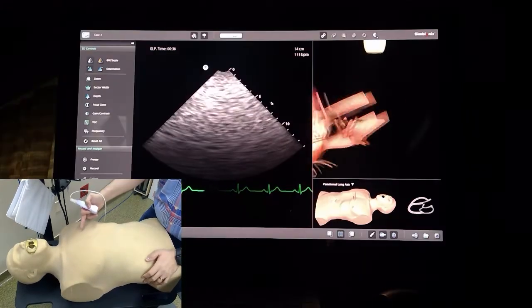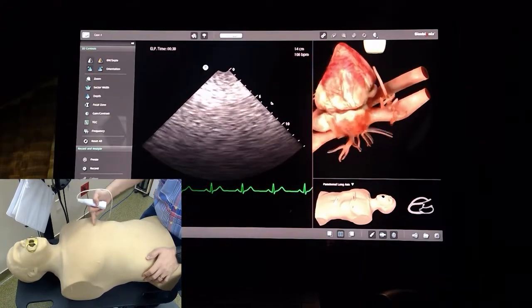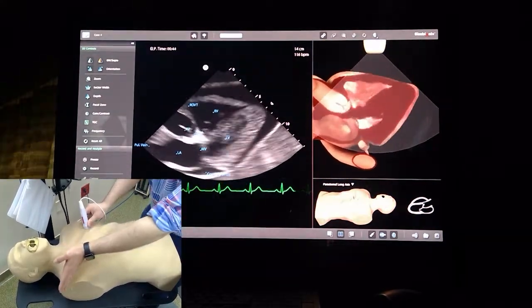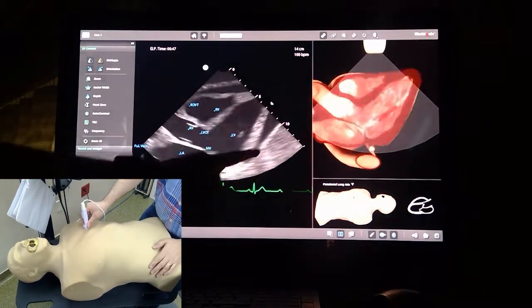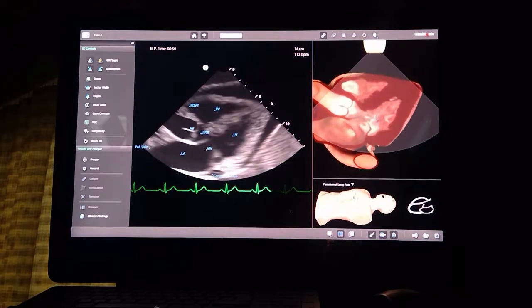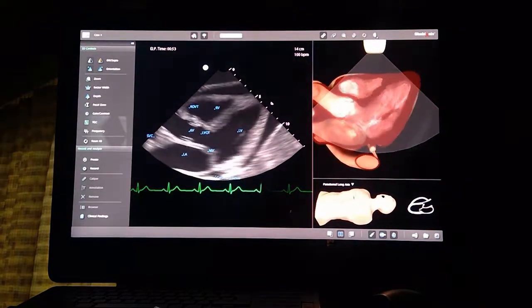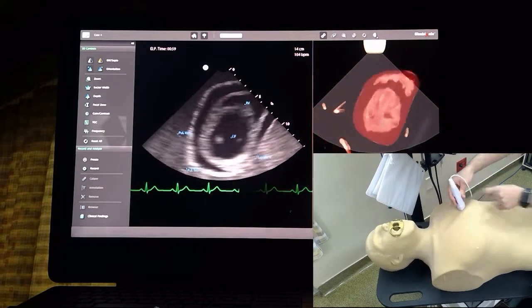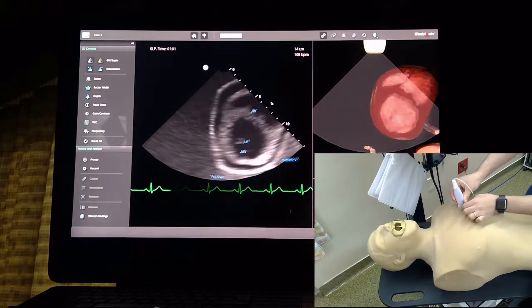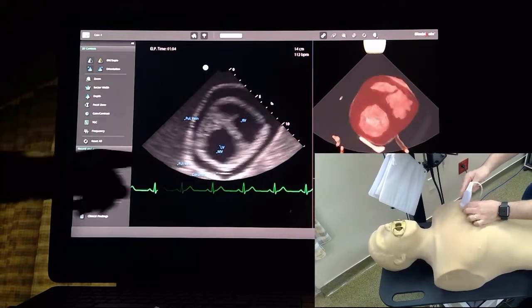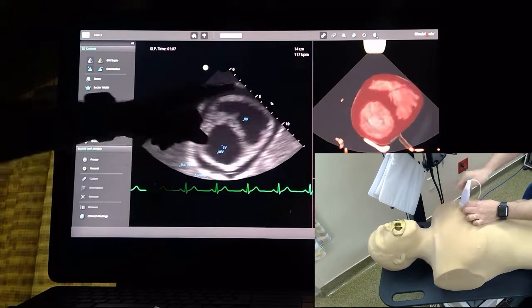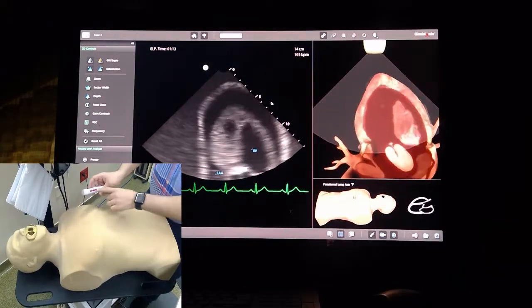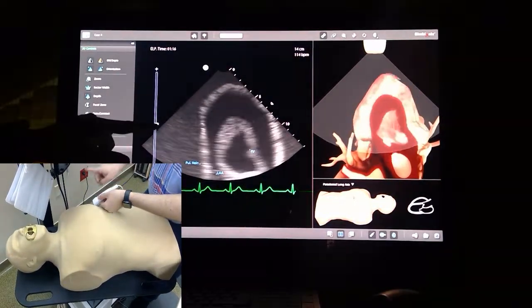On the parasternal long axis view, we can see the left ventricle and left atrium, and there is something outside the heart — the heart seems to be swinging or dancing around. This is the first clue. On the short axis view, we can appreciate that the heart is really dancing in this bag, most likely fluid.